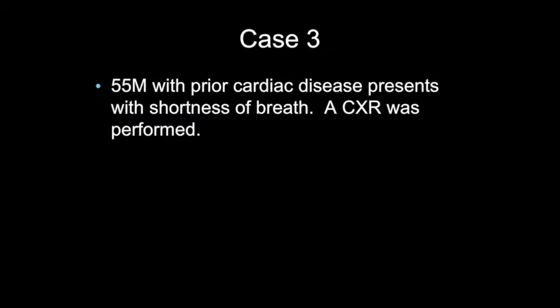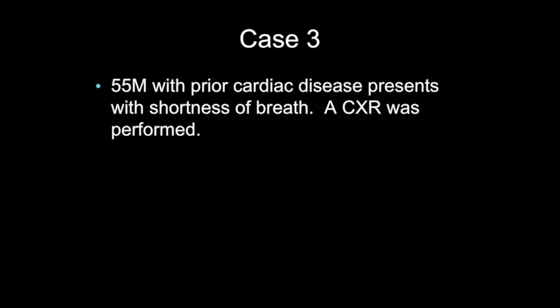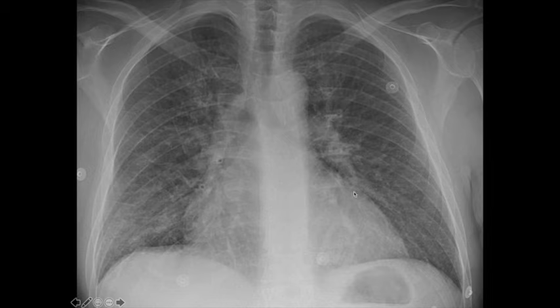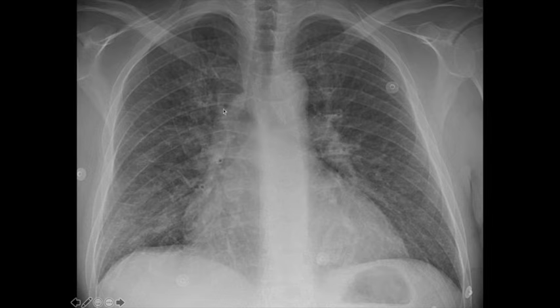Case 3: 55-year-old male with previous cardiac disease presents with shortness of breath. Going through our approach: the heart is too big — the cardiothoracic ratio is above 0.55. Comparing the lungs, there's no consolidation or nodules, but there are too many lines. There is also evidence of peribronchial cuffing and haziness of the vasculature. This is a case of pulmonary edema.